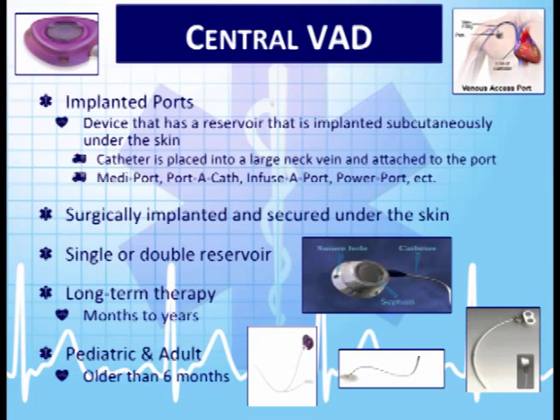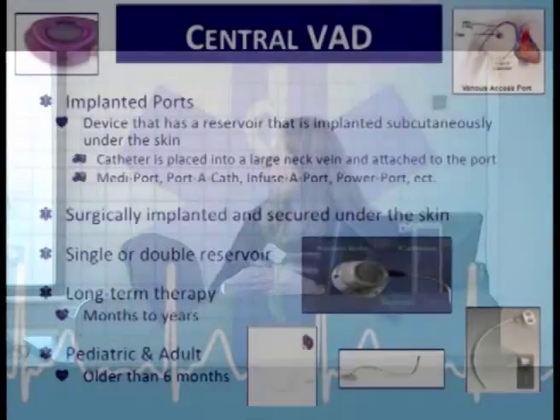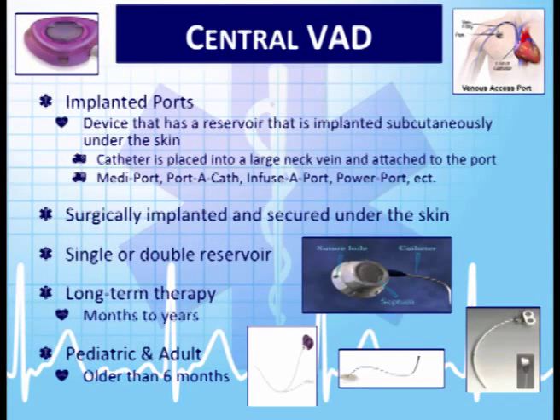There's a specific needle that's used to access MedPort devices. The nice thing is long-term therapy. So patients that may have chemotherapy or need long-term treatment. In a clinical, we had a child at Children's that had a blood disorder that he needed medication every day at home. Mom accesses his MedPort, gives him that medication, and then de-accesses that MedPort. So that might be used for that. Pediatric and adult, over 6 months old, those are put in. You can see underneath, either on the right side here or on the left side, it usually is in this area.